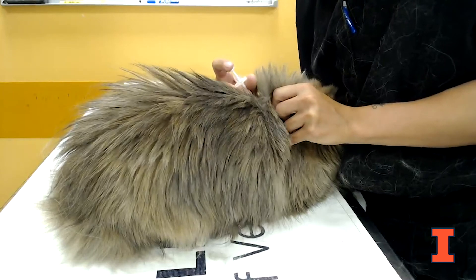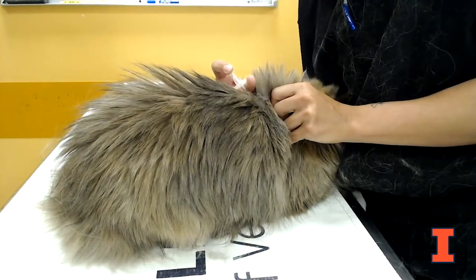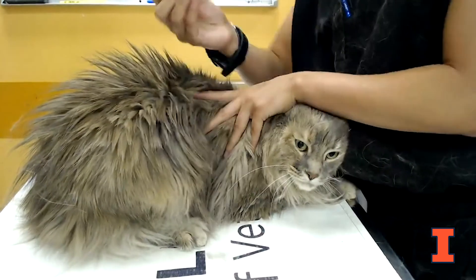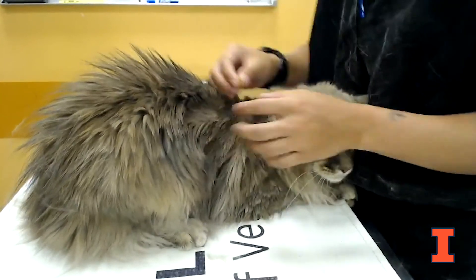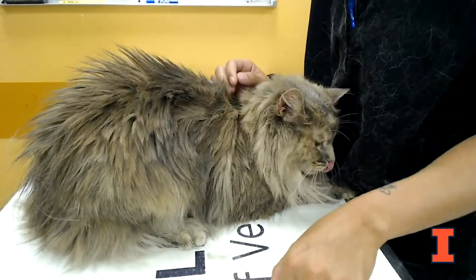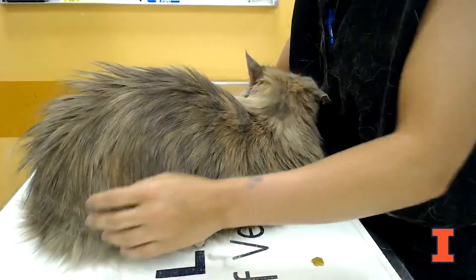You want to make sure you get the needle under the skin — especially on a fluffy cat — and then dispense the syringe. You can offer them treats to make it a more positive experience, but being such a tiny needle, oftentimes they don't seem to notice it a whole lot anyway.